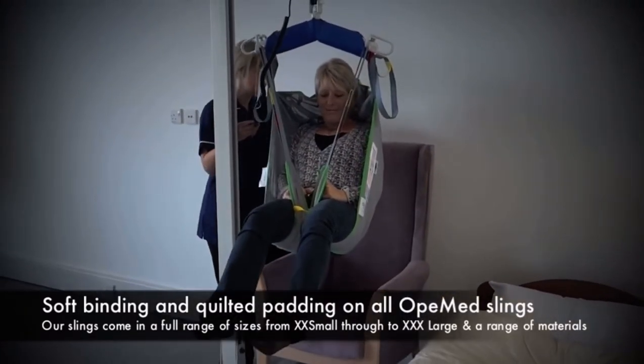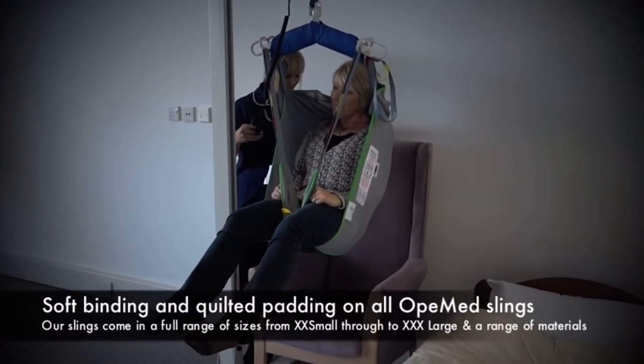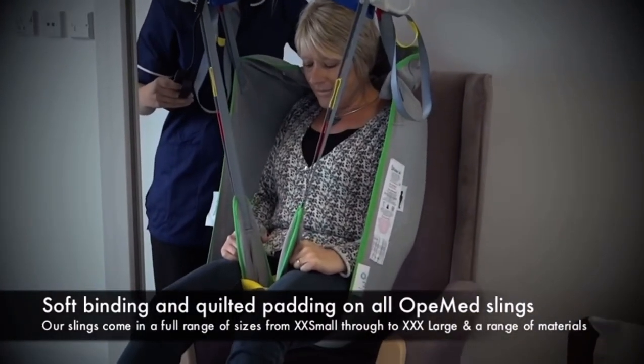As the client is lowered into the chair, there is a handle at the back to ensure that the client sits right at the back of the chair.